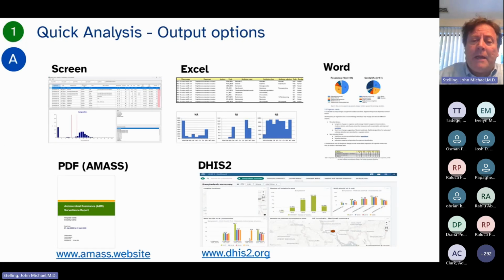In the lower right-hand side, we also feel very important about the concept of interoperability. I mentioned earlier with BacLink. If you have many different systems, you want interoperability on the input side so that WHONET can collect data from a variety of systems. It's also very important on the output side, so the data can be managed and utilized in WHONET, but to export data to other platforms such as WHO GLASS, such as FAO InFARM, such as DHIS2 for public health reporting and data visualization.